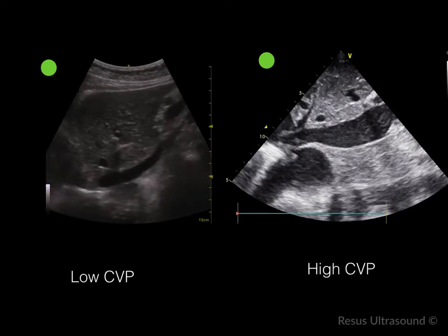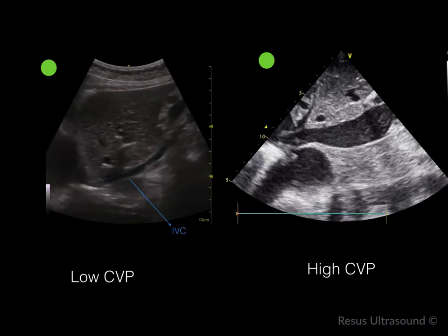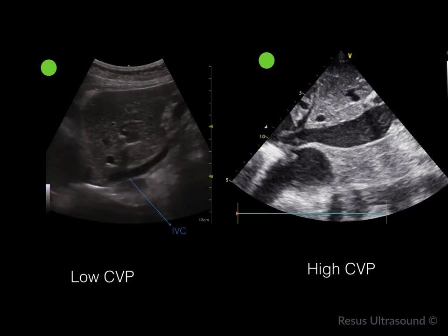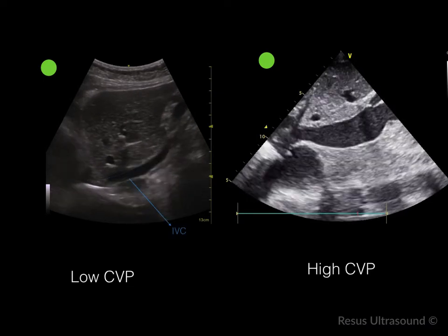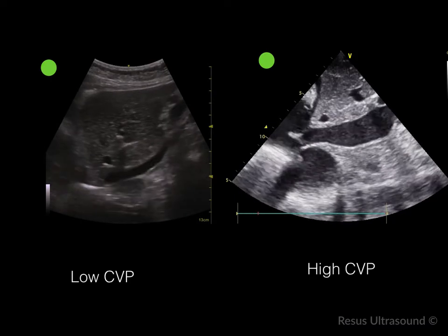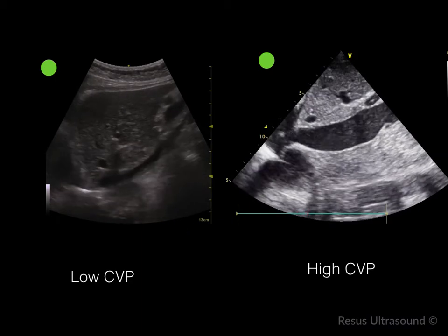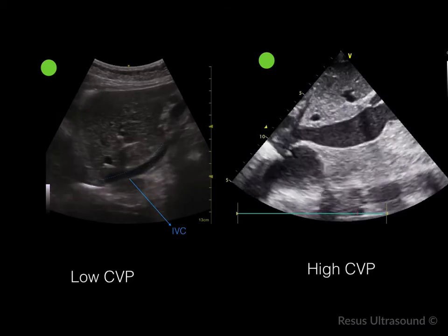In 2D examples: on the left, the IVC is very thin and when you breathe in there is no space at all — this means the patient should be volume responsive when presenting with shock or dyspnea. On the right side of the screen, the IVC is very large and doesn't collapse at all whether in inspiration or expiration — this patient has high CVP or does not respond to volume anymore.